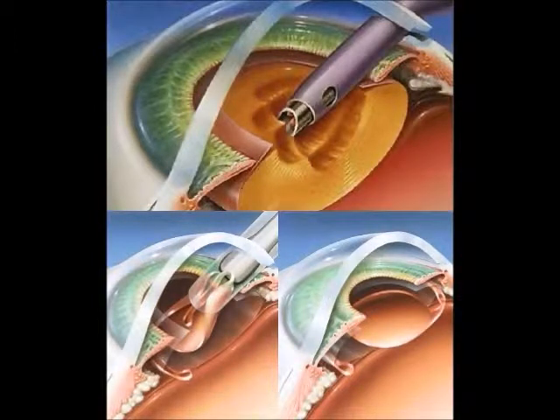Using an ultrasonic tip, the operating surgeon then uses vibration waves to cut the lens, fragmenting and emulsifying the clouded lens particles. The smaller pieces are removed, and in its place, the intraocular lens is put there.